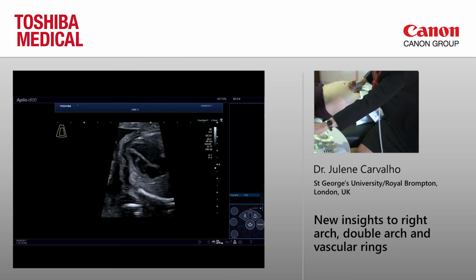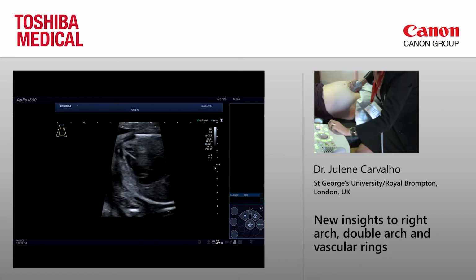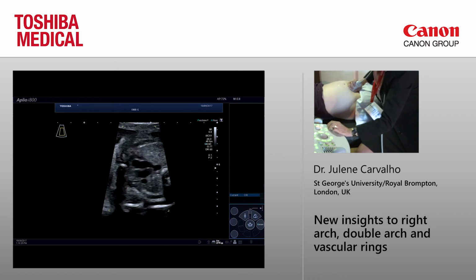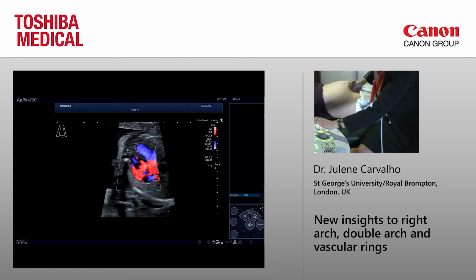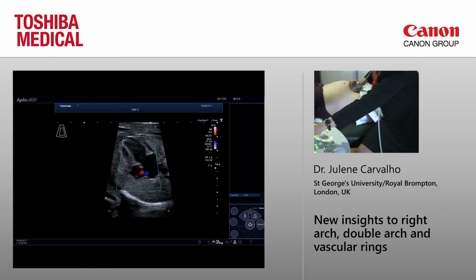I just change the frequency to high frequency so we can see better definition here. So you all know about the 4-chamber view. So we come here to the 3-vessel trachea view. Right-sided over here, superior vena cava, aortic arch, and pulmonary artery, the ductal arch. So I'm going to put the color and split the image.